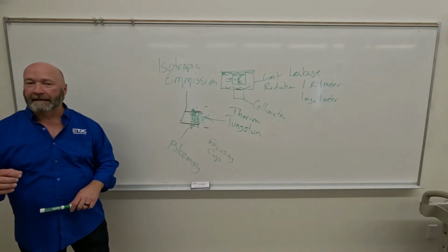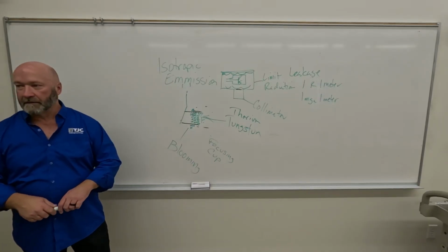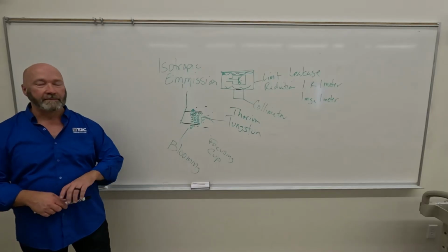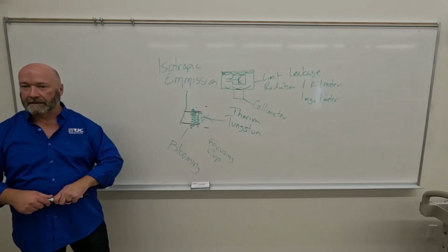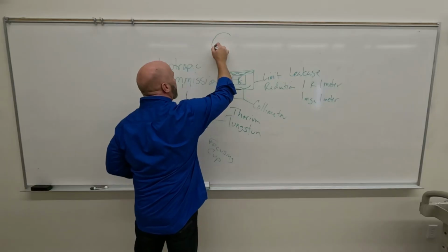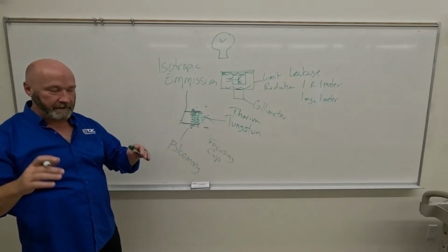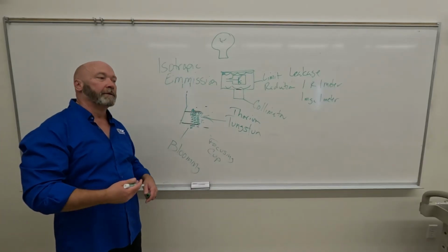Light bulbs, incandescent light bulbs, the ones with a filament, also use tungsten. Okay, so do they last forever? The answer is no, they don't. So one burns out and you unscrew it and you look at it, and what do you see? You got a light bulb, it goes like that. Coil's broken, okay, so you got an open filament, and by the way, open filament is a reason for tube failure.